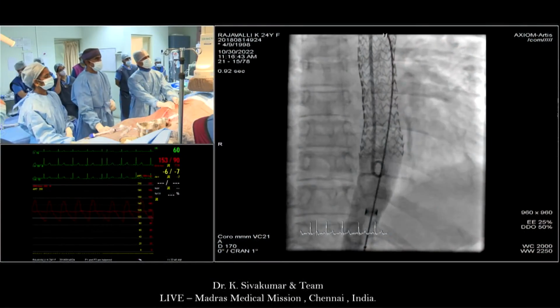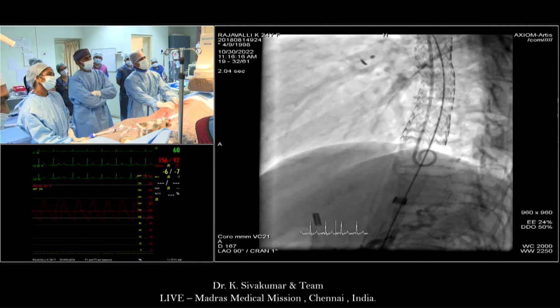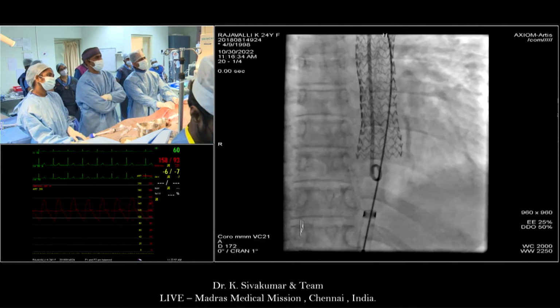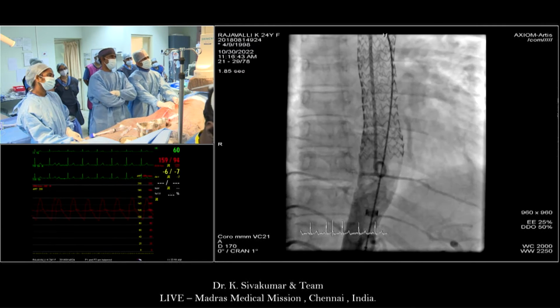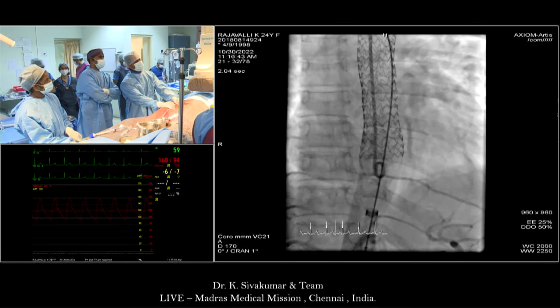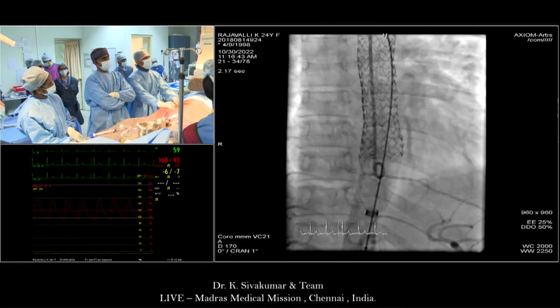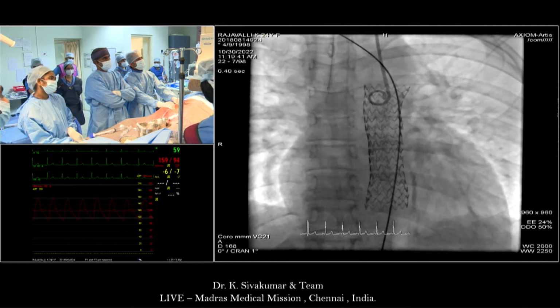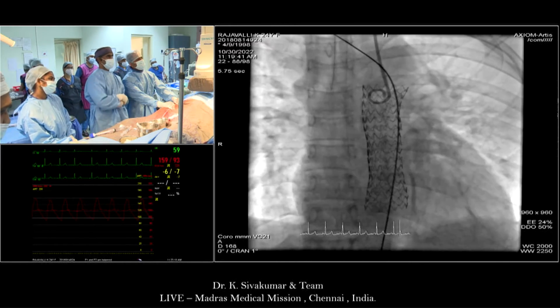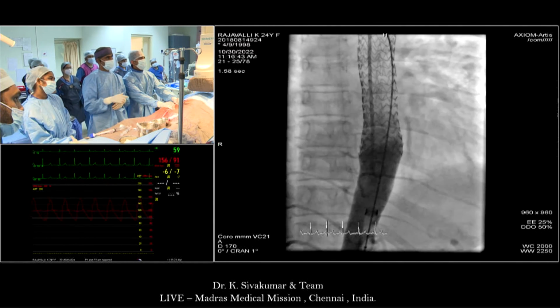See, what we did was, am I audible? Yep. We flared the distal end with the Taishak balloon, which was made by 2 masters in pediatric cardiology. This is the distal end flared with a 20 millimeter into 4 centimeter balloon distally. Show the next picture. This is the proximal end again flared with the same 20 millimeter. Show the previous one, lateral view also. No, not that one. The previous.